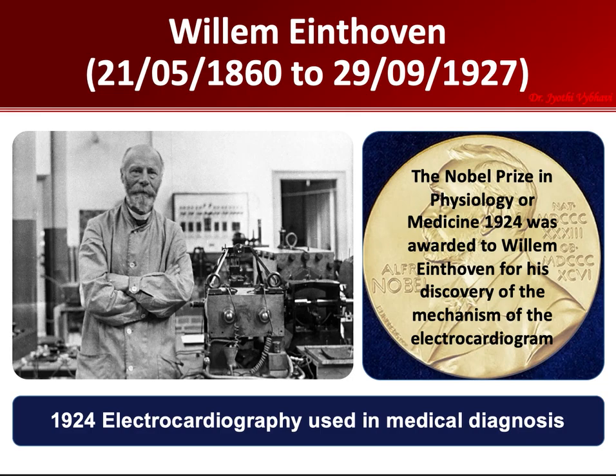And the names of the waves, PQRST, were also coined by Einthoven. So he did a lot of work on the ECG. Einthoven continued to develop electrode arrangements. He started placing electrodes in different parts of the body and recording the electrical activity. When he was doing this, he standardized. He came across lead 1, 2, and 3, and he called them the standard limb leads.